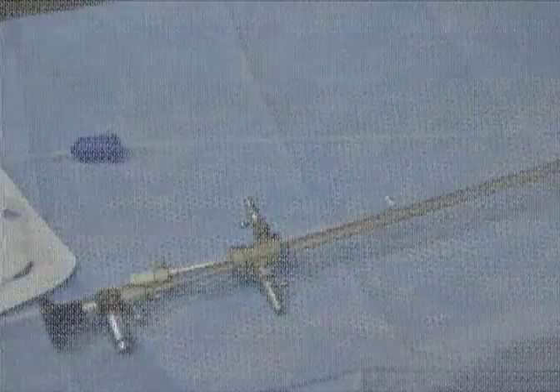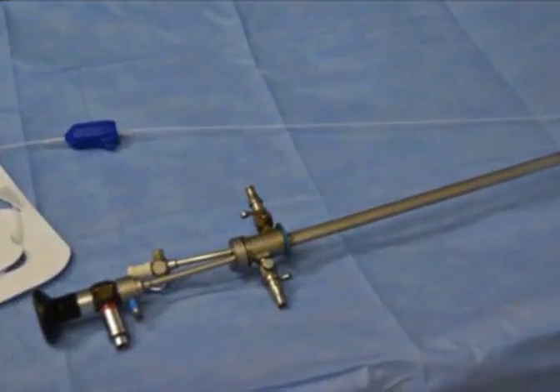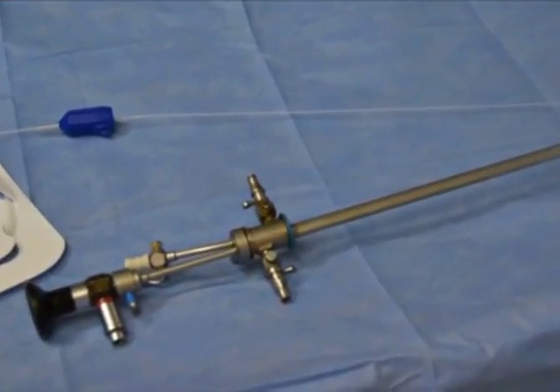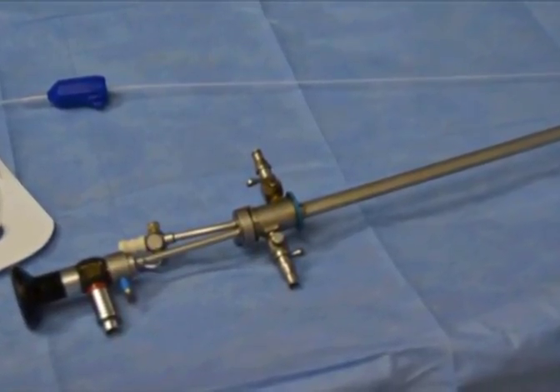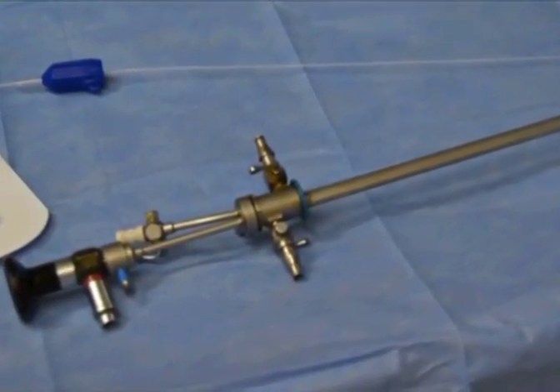This fiber has a handpiece to control the fiber. A continuous irrigation 23 French sheath and a 30 degrees telescope from Storrs, Germany is used for the procedure.